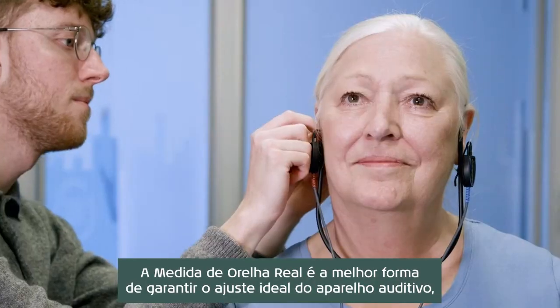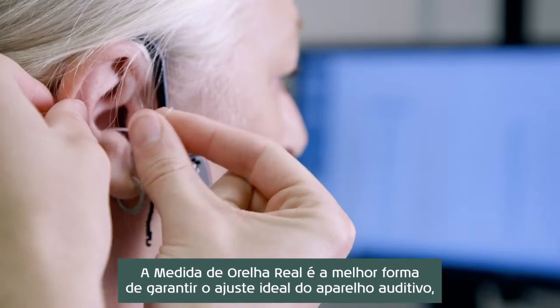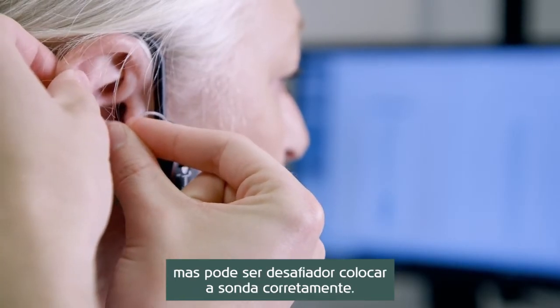Real ear measurements are the best way to ensure an optimal hearing aid fitting. But it can be challenging to place the probe tube correctly.